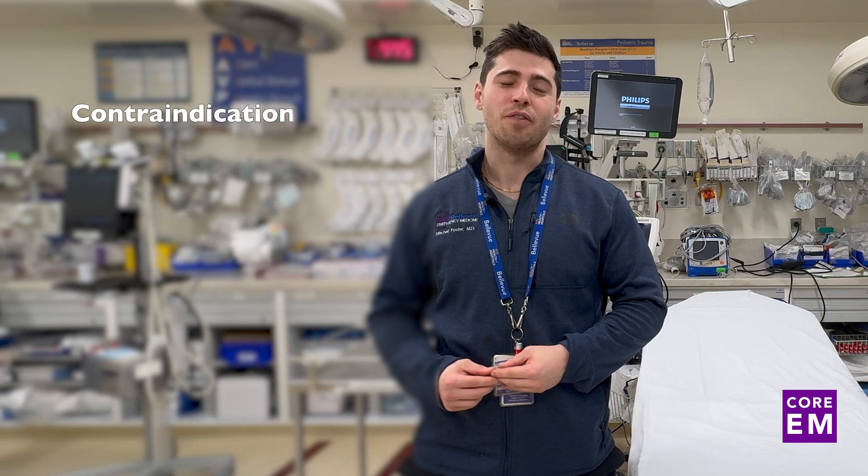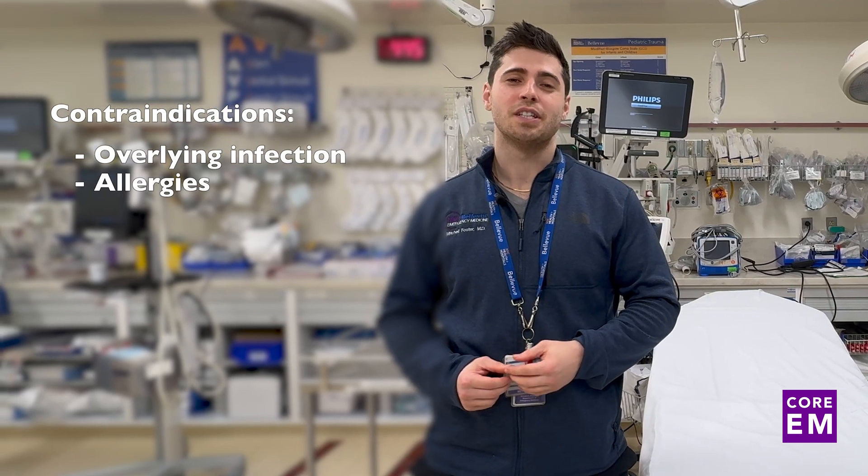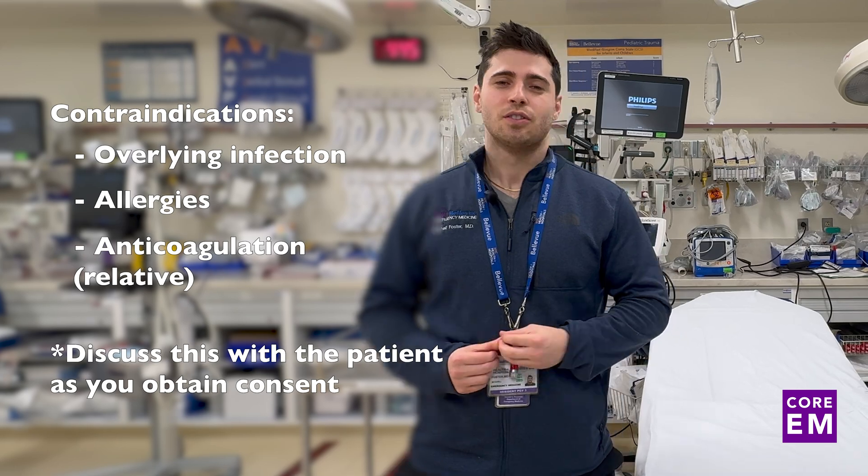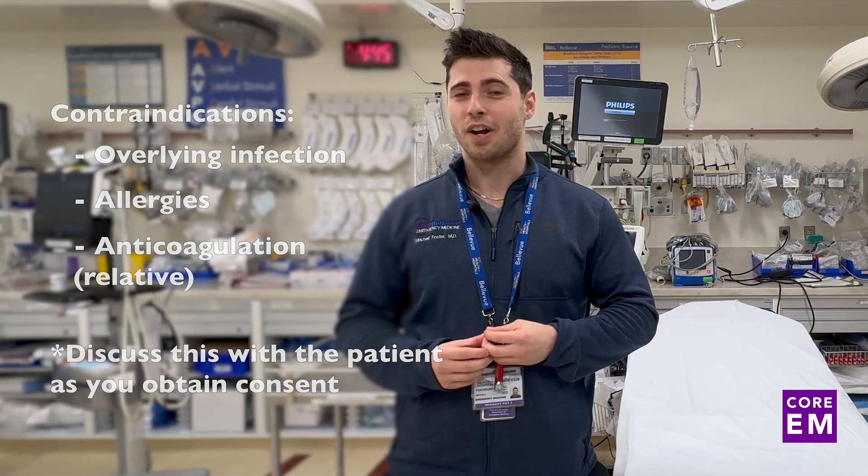Contraindications to this procedure are infection overlying the site, allergy to anesthetic, or a relative contraindication is anticoagulation. So let's get into the nerve block, the different aspects of what you'll need for the nerve block, the ultrasound anatomic considerations, and some other fine tips.